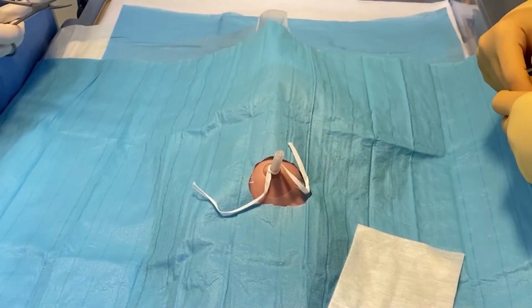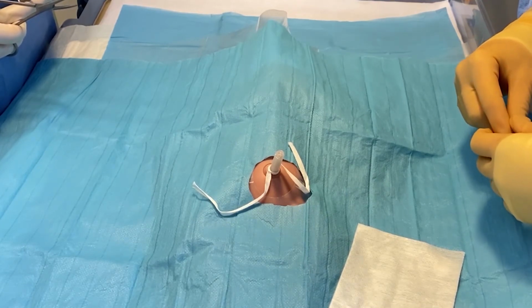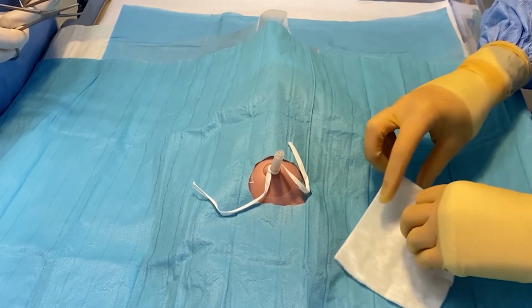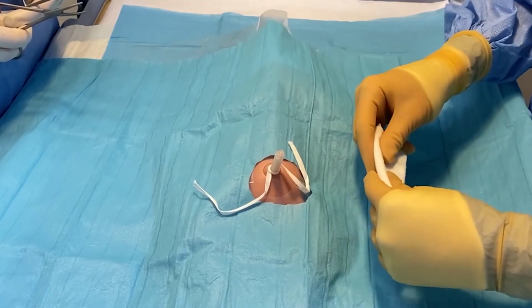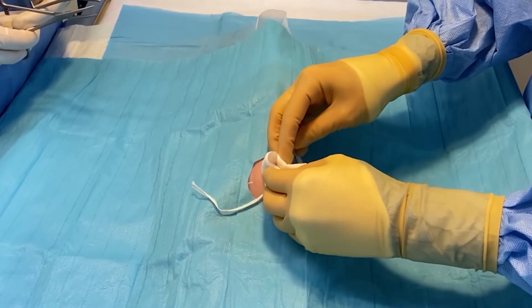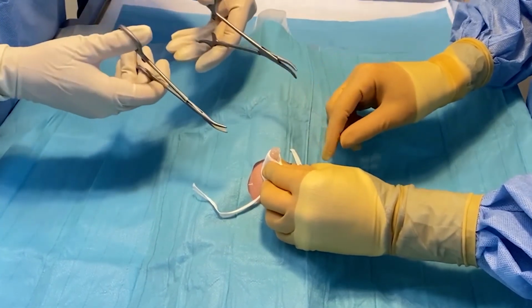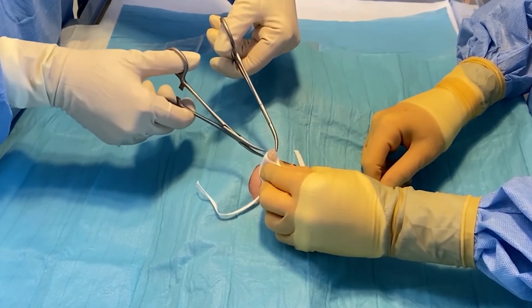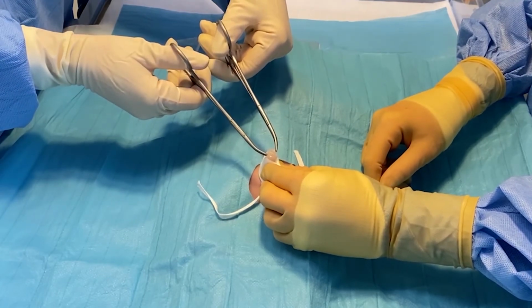When it comes to inserting the umbilical lines, there's a couple of techniques that you can employ. You'll notice that the umbilical cord can be quite slippery and difficult to stabilise. So one technique is to use a piece of sterile gauze and wrap it around the cord, enabling you to hold it securely. Alternatively, you can use forceps to clamp the edge of the wall of the cord and stabilise it that way, or a combination of the two.